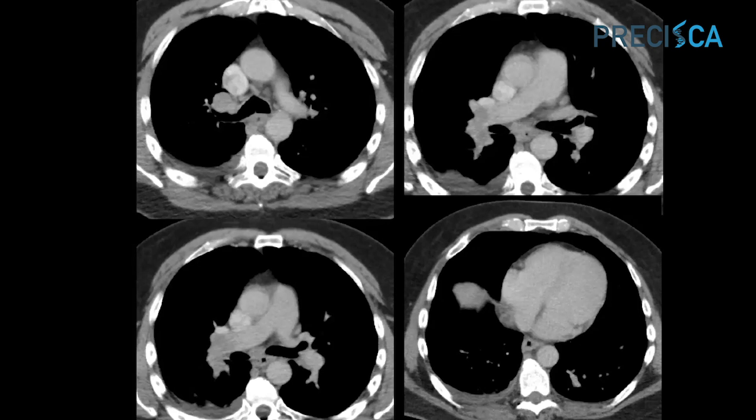So our concern, when we are seeing a patient with a history of neoplasm, when we see a filling defect that is just classic thromboembolic disease, we expect it to be low attenuating without enhancement. If we see anything that looks like enhancement, our antennas go up that there could potentially be tumor emboli, and then we have to start considering whether or not there's a role for doing either a PET CT or an MRI to help confirm the diagnosis. Very rarely is biopsy performed in these patients because it's invasive and usually it's not needed to make the diagnosis.